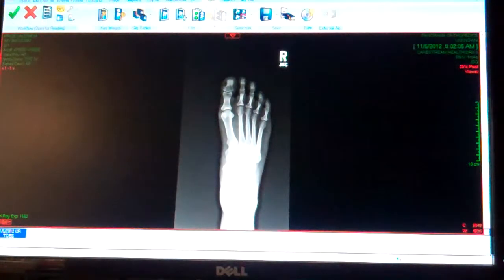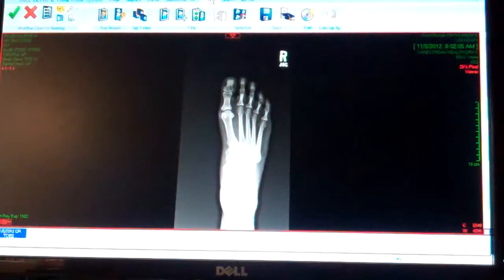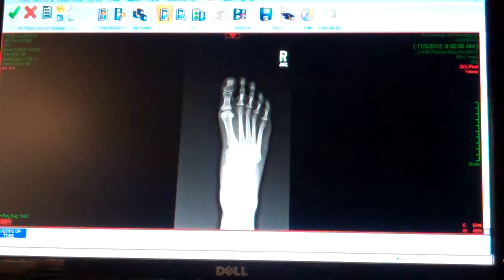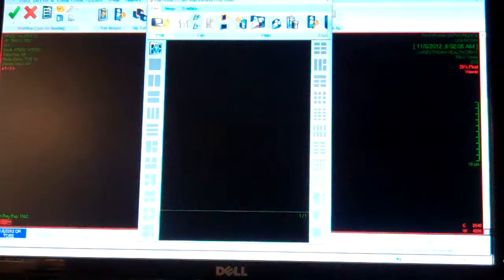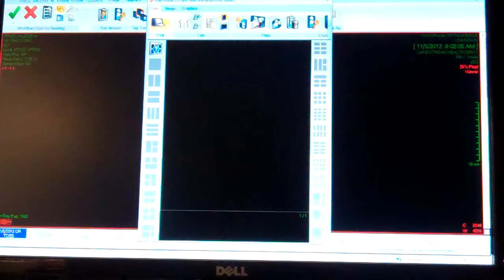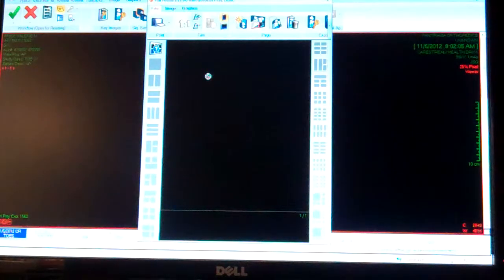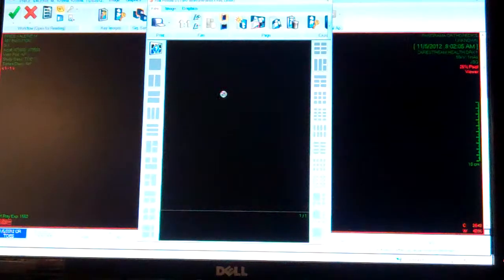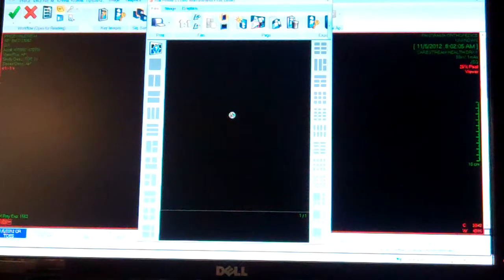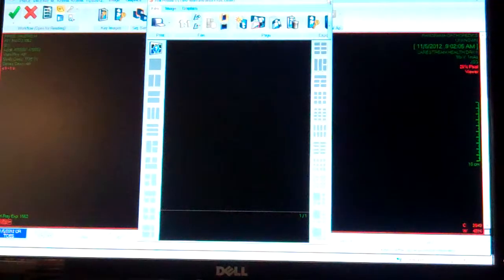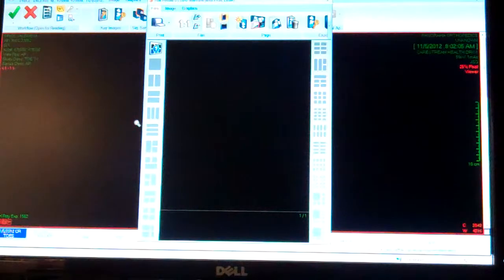Export is where you'll go to print. When you're in Export, the film viewer is the same icon as before. It's going to pull up the same blank box and you're going to drag the images into it that you want to print.